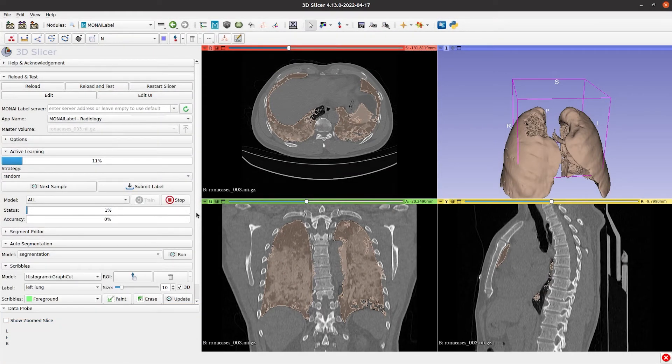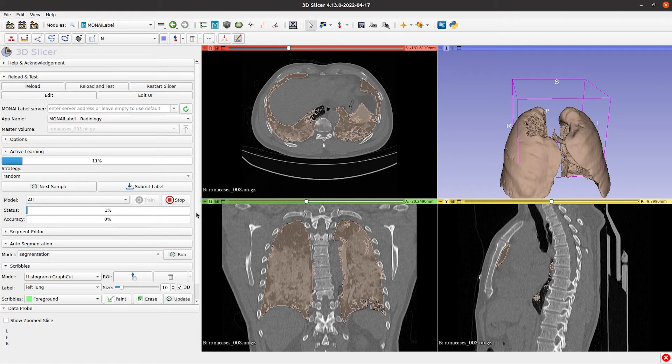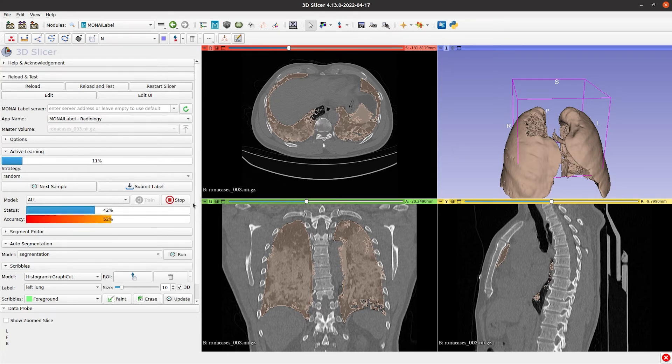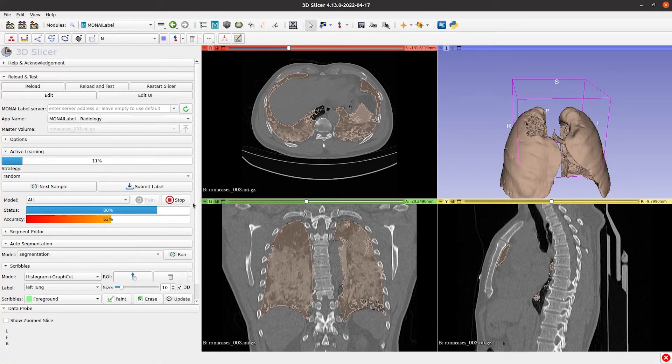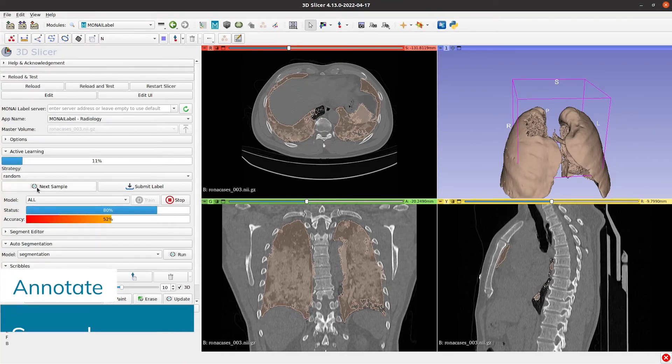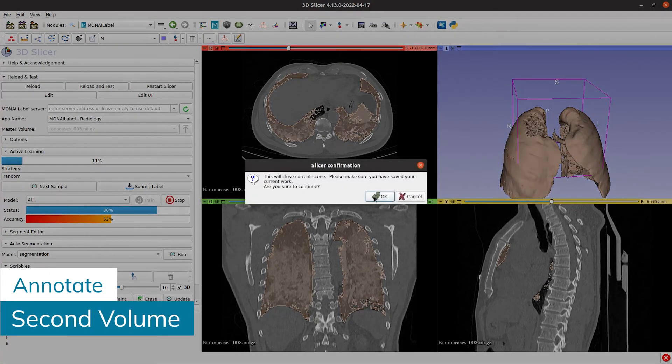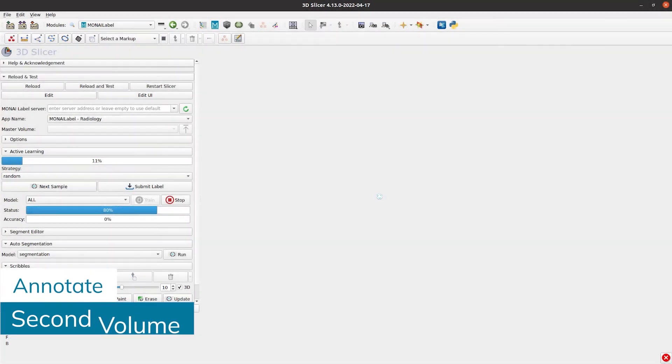There are actually two approaches you could follow. One is to annotate one image and trigger the training, or annotate more than one volume before triggering the training. We continue the annotation of a second volume while the training is happening in the background.